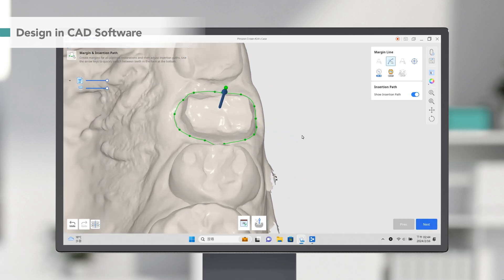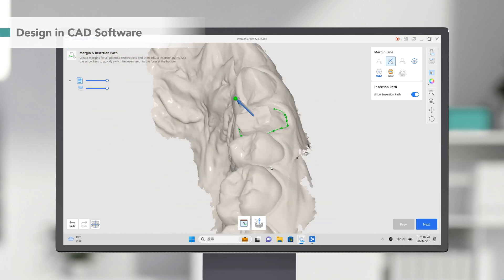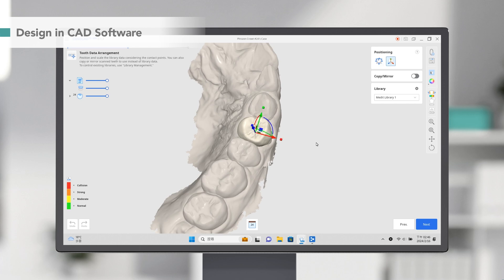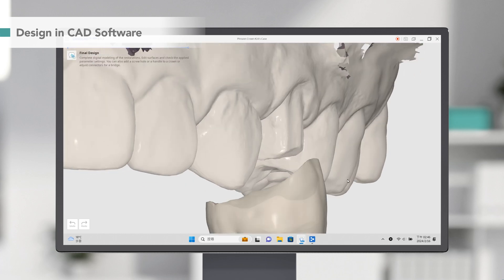Then draw a margin line around the tooth and set up the insertion path for the crown. For the shape of the crown, head to the Library menu, then select the type and adjust its size and angle. Use the Brush tool to finish up the details.